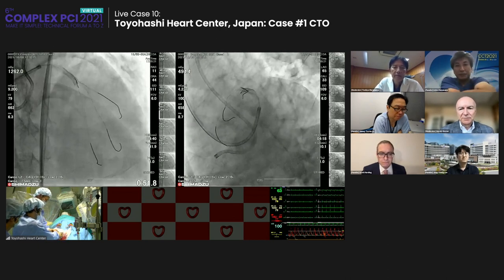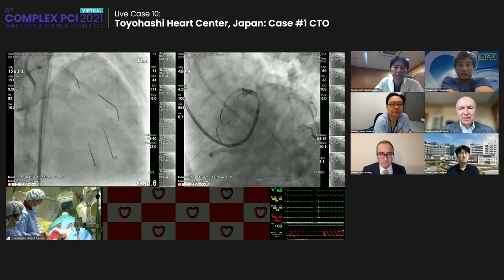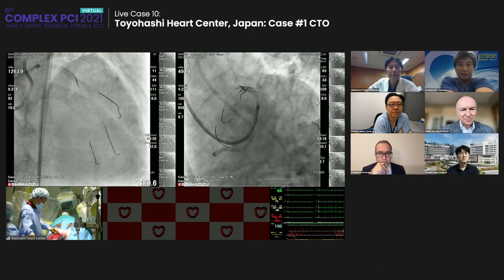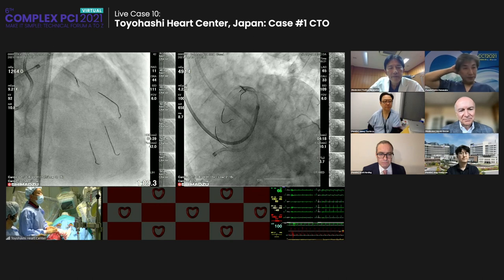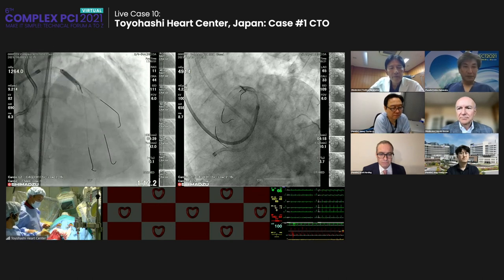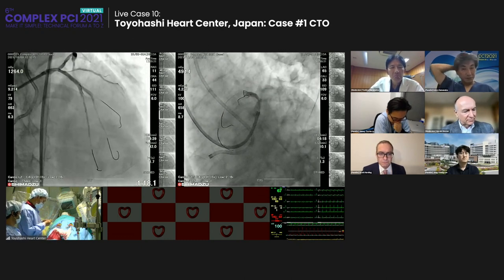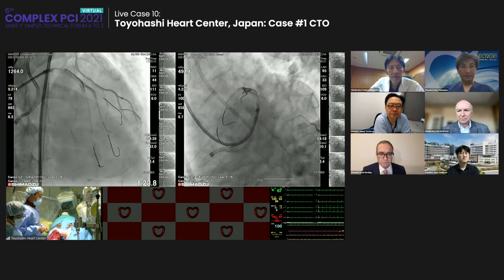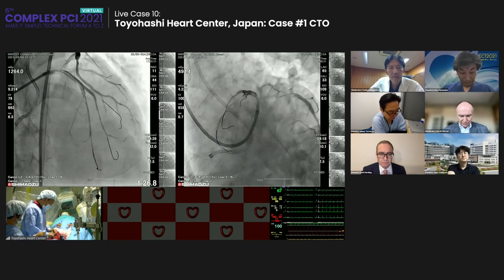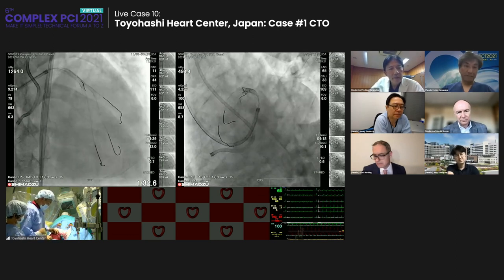Yeah, one can assume if you have a penetration power to get through a plaque from a subintimal position, and you direct it towards the adventitia, it might easily end up in no man's land. But the penetration success rate is very high compared with the current ADR Stingray system. So penetration efficiency itself with plasma ablation is very nice. So if we can see the real perpendicular view for the CTO exit, we can penetrate with plasma ablation very easily.